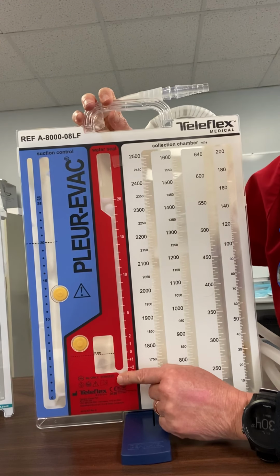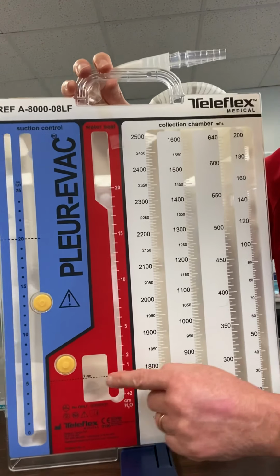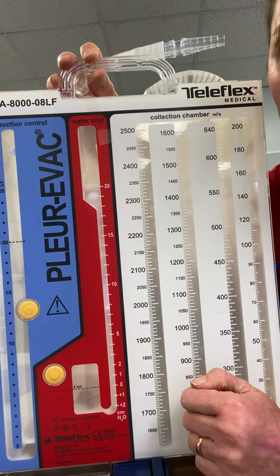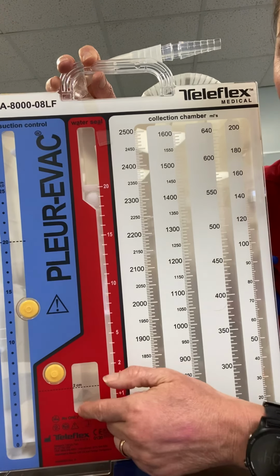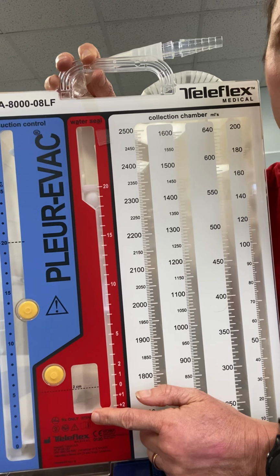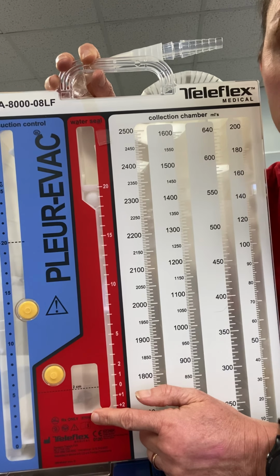This is the water seal chamber. This is where you're going to look for an air leak. You're going to fill this up to 2 centimeters of water right there. Once you do that, when the patient breathes, there's going to be tidaling. It's going to go up when they breathe in and down when they breathe out. This is the chamber where you are going to see an air leak. So look for a small intermittent bubble when your patient exhales or maybe when they cough.